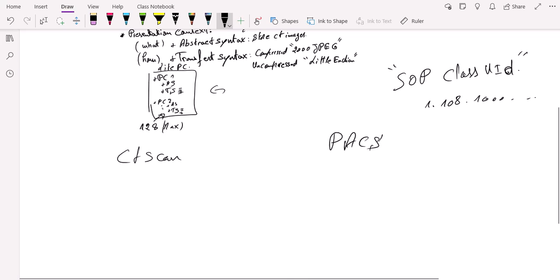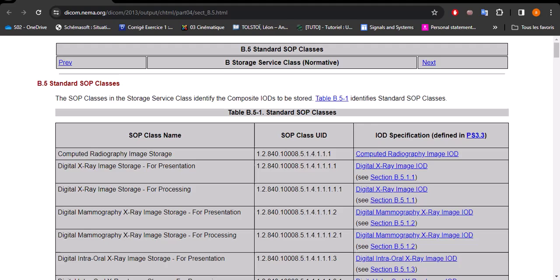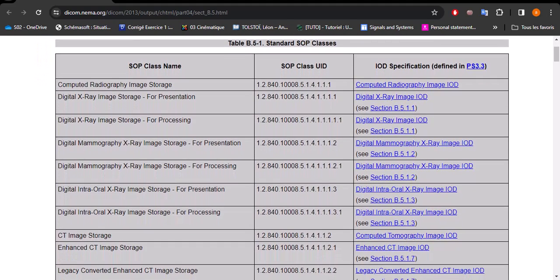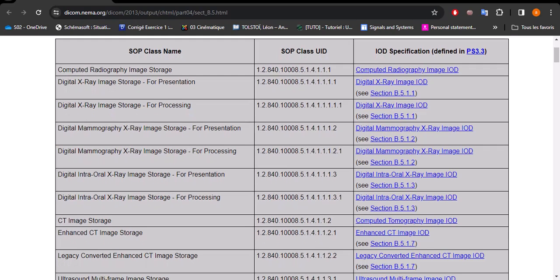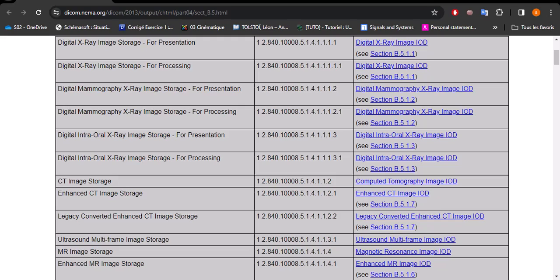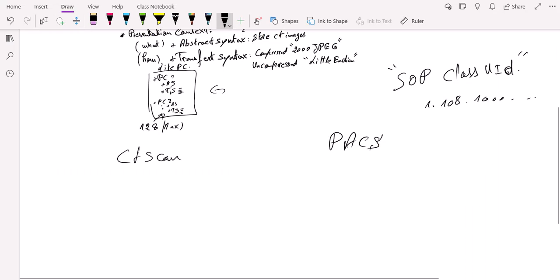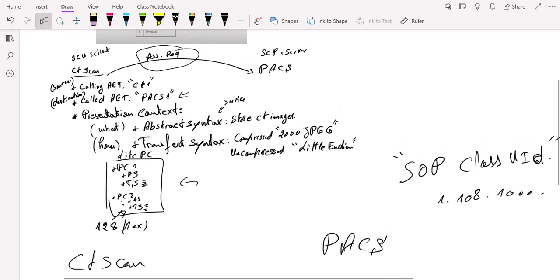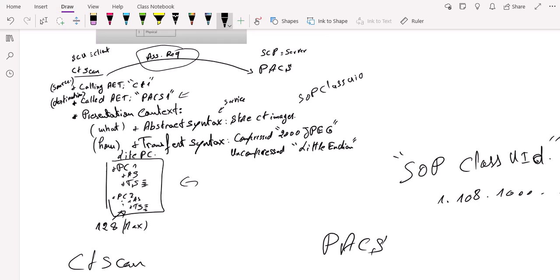You can see here, this is the SOP class UID, and these are the services. For example, the service that we want to use in our example here is the CT image storage. And you can see its SOP class UID here. That's what PACS would look for in his presets. So we're going to take this SOP class UID. I said here that we're going to send store CT image, and actually going to include the SOP class UID of that service. That's like, you can see it as the DICOM word, the DICOM way to say that I want this service.